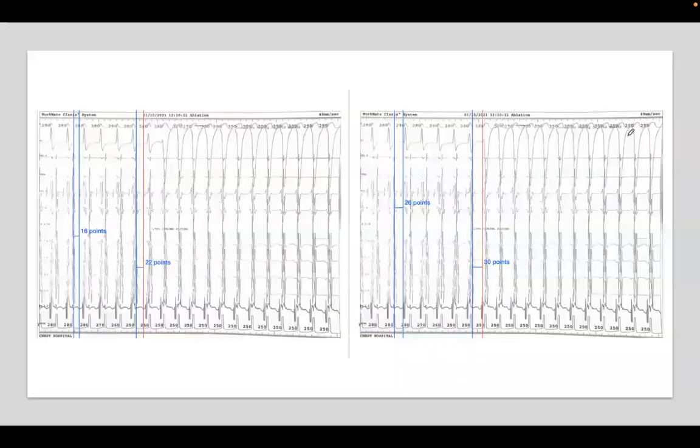Okay, going forward, it's a little bit small, and I apologize for this. But the AH interval, roughly, it's prolonging. It was 16, this is not milliseconds, just arbitrary numbers. It's AH clearly prolonging, like you observed, Wael. But if you see the AV, the AV is slightly prolonging.